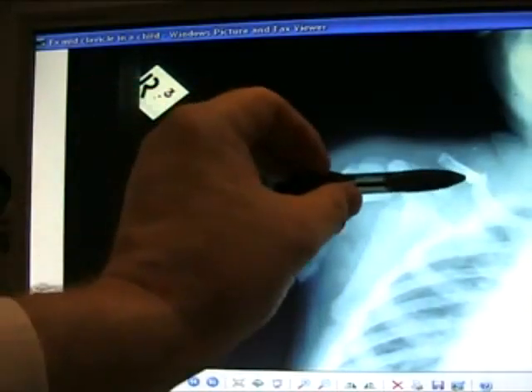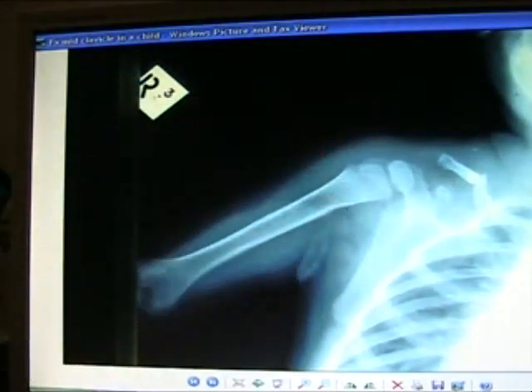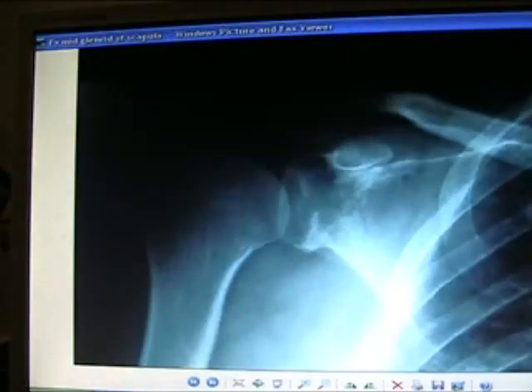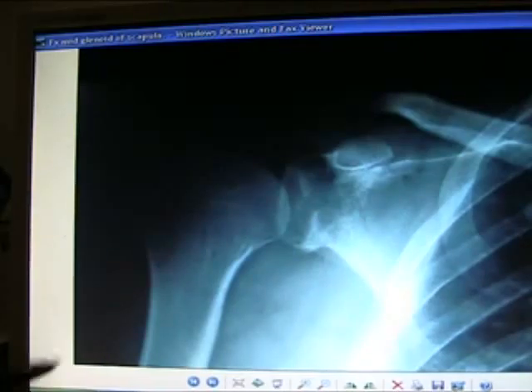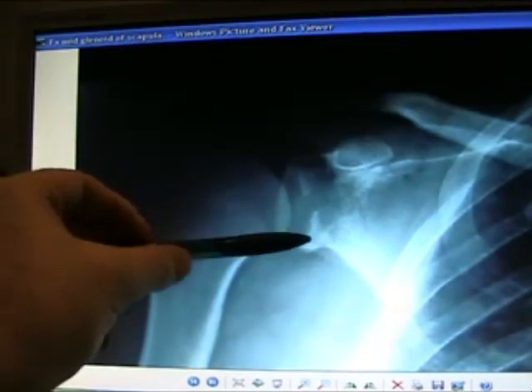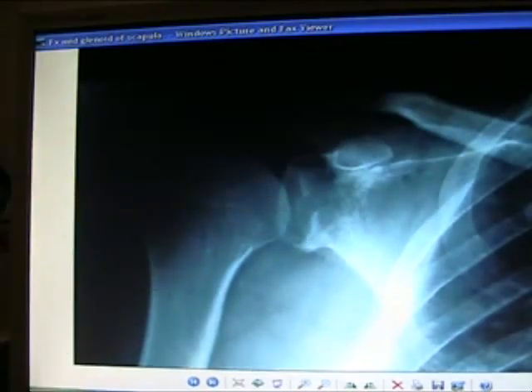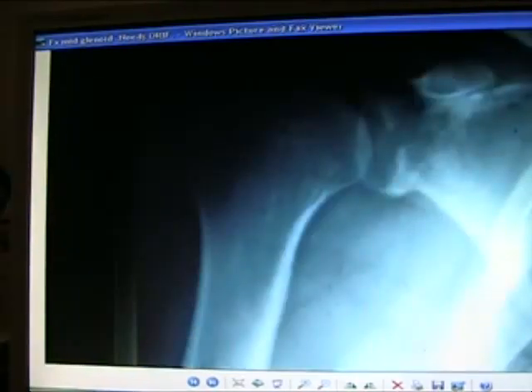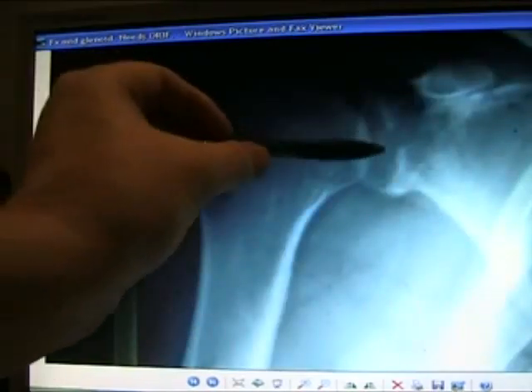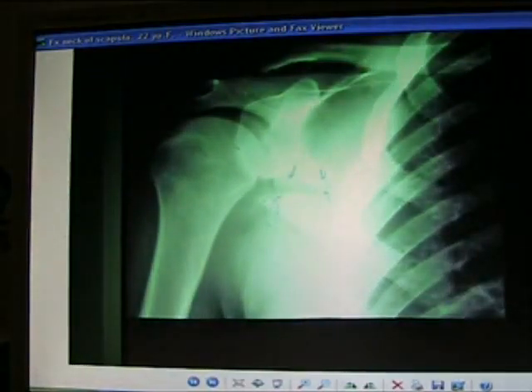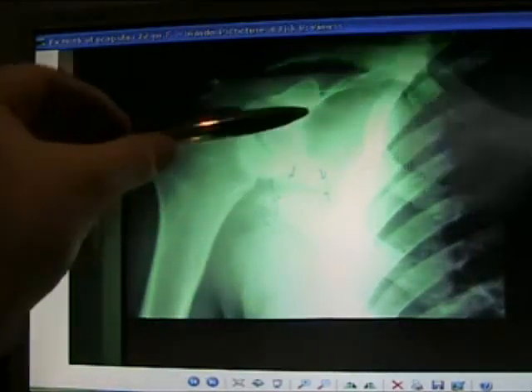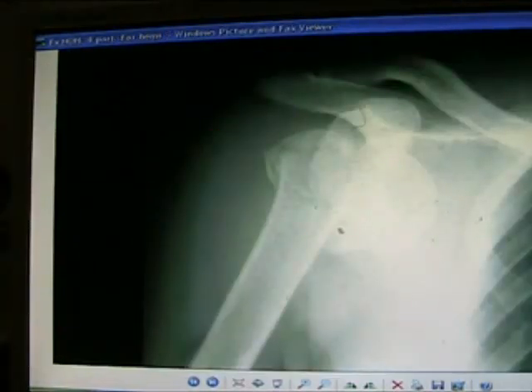Fracture of the mid-clavicle in a child — perfect remodeling, no operation needed. Mid-glenoid fracture — this will need open reduction internal fixation, as there is a large step-off deformity. Fracture of the neck of the scapula.